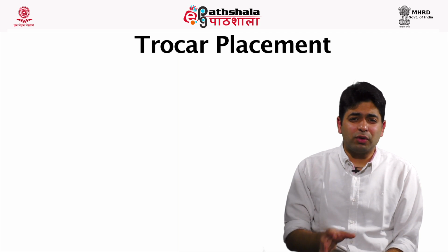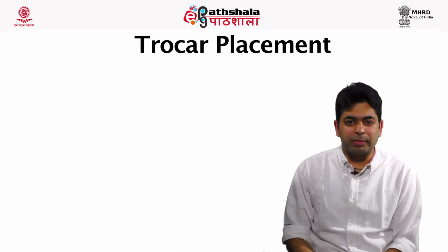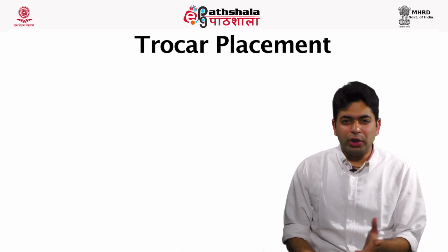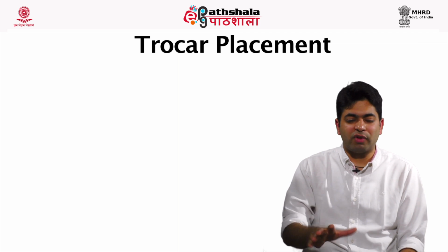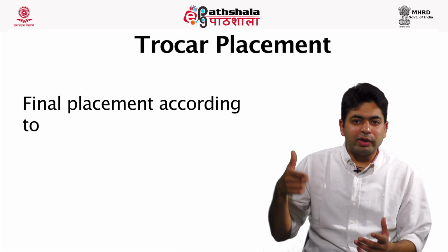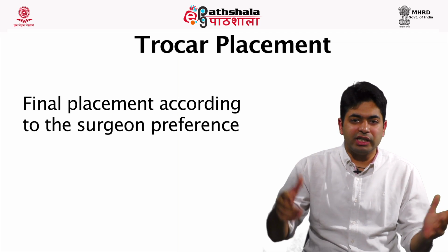Now the second one of the most important things, and multiple studies have been done on it, is trocar placement. Generally for surgeries like laparoscopic cholecystectomy, 3 to 4 trocars are used, but for more complicated surgeries, like bariatric procedures, up to 5 to 6 trocars are also used. So what is the final placement of a trocar? That is dictated completely by the surgeon's preference, how he needs them and where he needs those trocars.